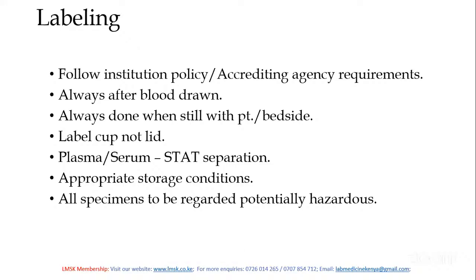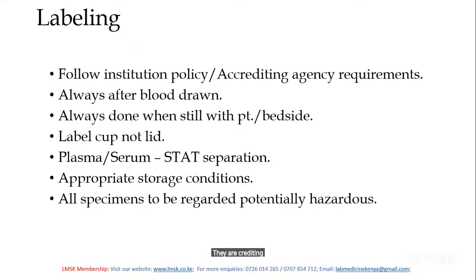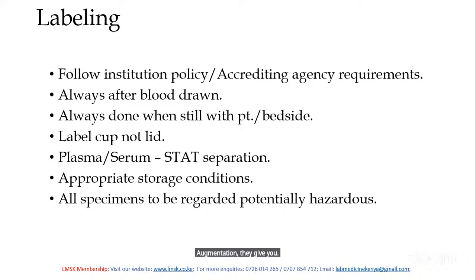So after collection of your blood, you have to label the specimen. The rule is, when it comes to labeling, follow institution policy and the accrediting agency requirements, kindly. Because when they come for accreditation, they give you their requirements.